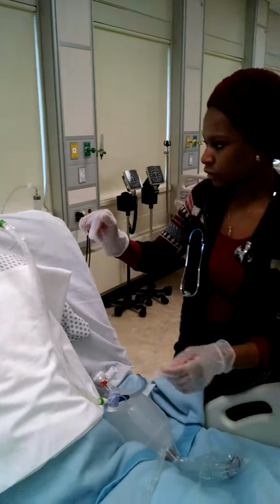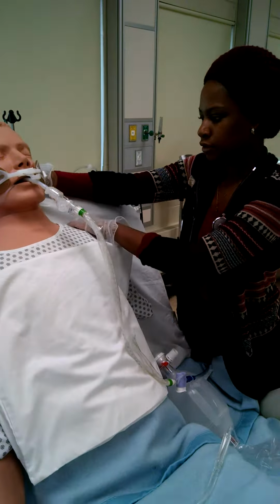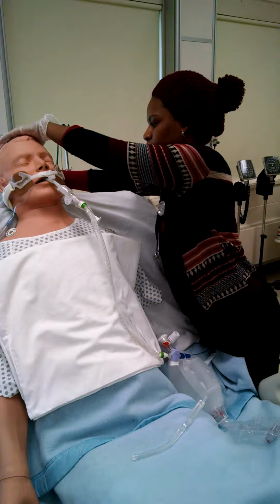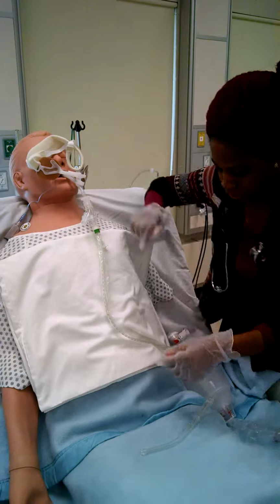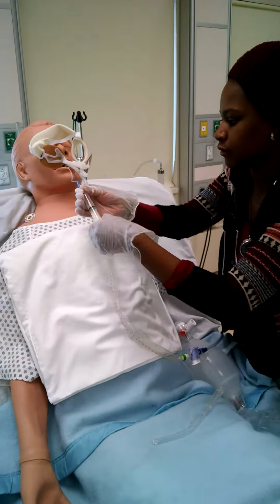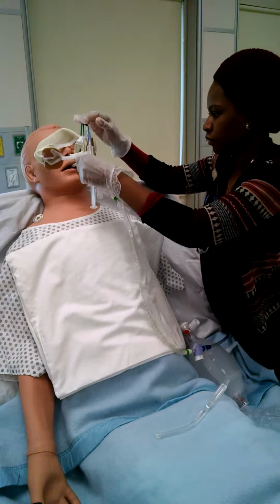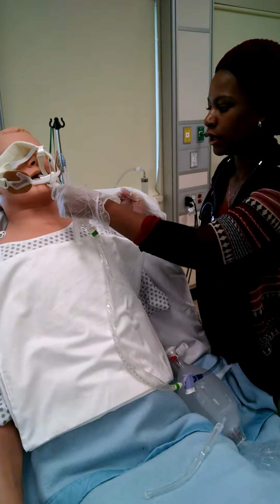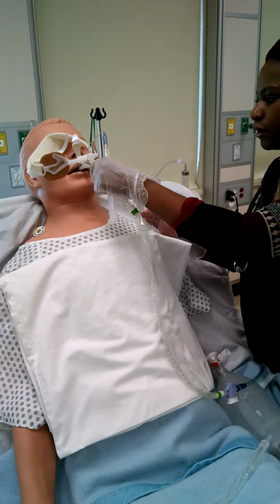Okay. Now I'm going to go ahead and remove the ET tube holder. Oh, and I'm going to deflate the cuff. I would ask the patient to take a deep breath to abduct the vocal cords as much as possible on the peak inspiration. Could you take a deep breath for me, sir? Okay, great.